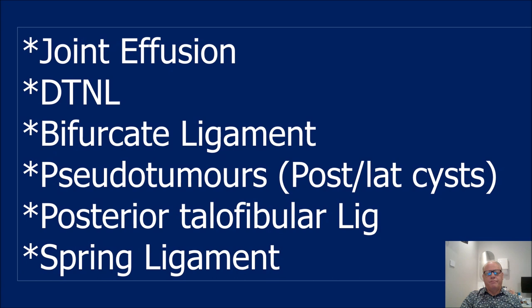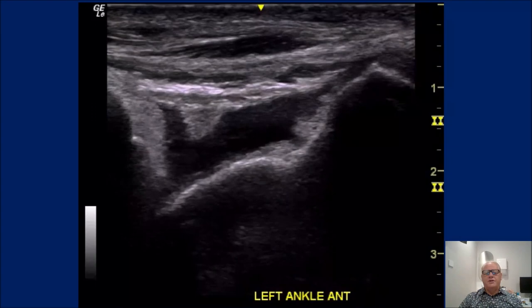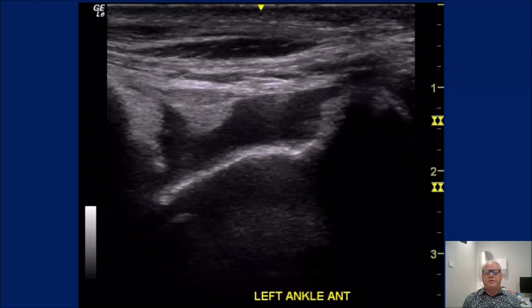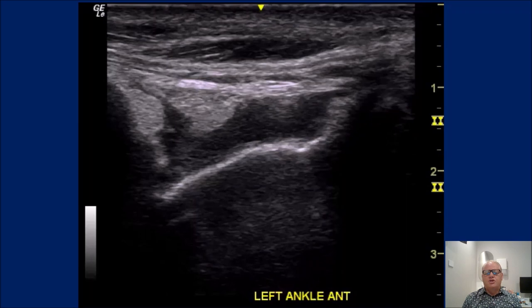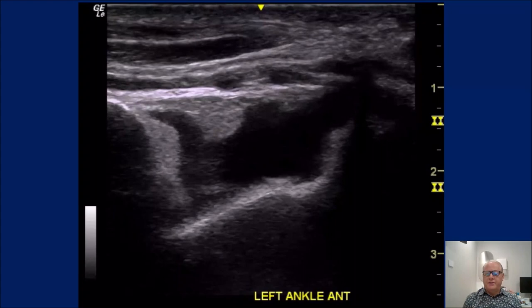What I want to look at now is joint effusion, dorsal talonavicular ligament, bifurcate ligament, pseudotumors, posterior talofibular ligament, and the spring ligament — these are not really well documented in protocols, and there's lots of pathology that can be missed here. Joint effusion is normally in the anterior joint recess — when we dorsiflex we can see the fluid moving. Joint effusions are the first thing that come with a significant injury, they tell us the injury is significant. It's the first to come and the last thing to go — swelling is the last thing to go.